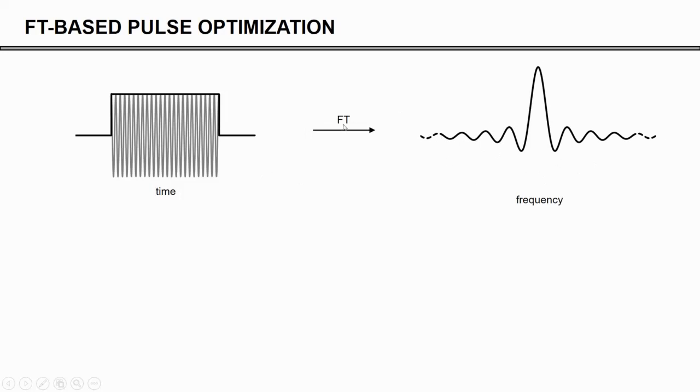Now, the Fourier transformation is a reversible operation. So if we have an RF pulse that has a sinc modulation, then you would expect it to be a frequency-selective excitation profile, right? One goes with the other. So let's try that. Now, unfortunately, the sinc function is an infinitely long function, so you can never really apply that in reality, so it needs to be truncated. And typically it is truncated at the 3rd or 5th or 7th zero crossing.